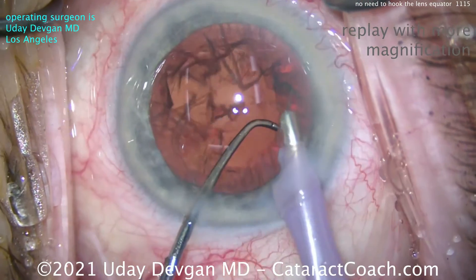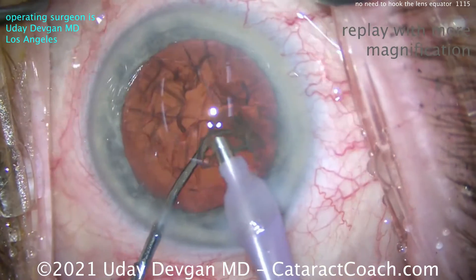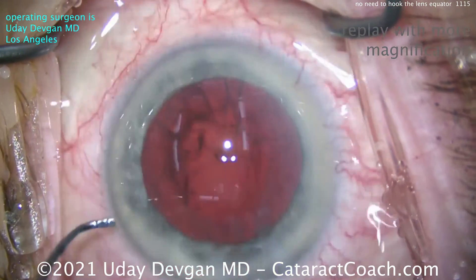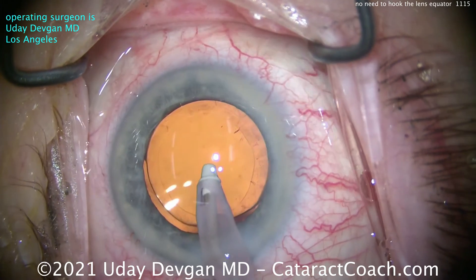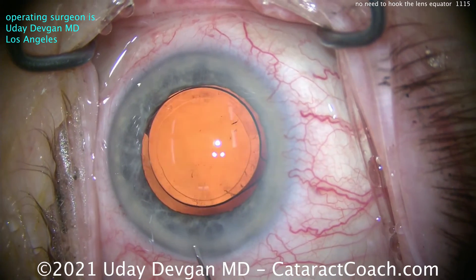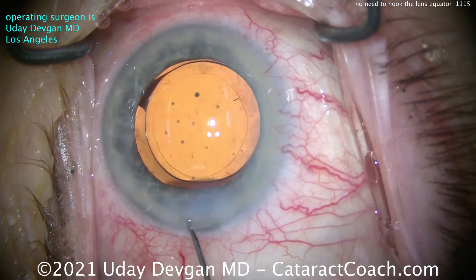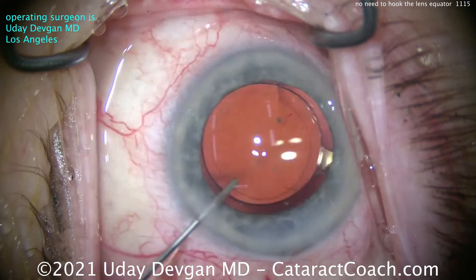That looks great — taking out a little bit of an epinuclear shell and there's the last little piece. Very nice technique; you can certainly learn this, it's just not that hard. Fast-forwarding to the end of the case, you can see the rhexis — a 5mm capsulorrhexis with a 6mm optic — and that lens is beautifully centered. Sealing up the incision: this is a bare minimum amount of phaco energy, a very efficient case.